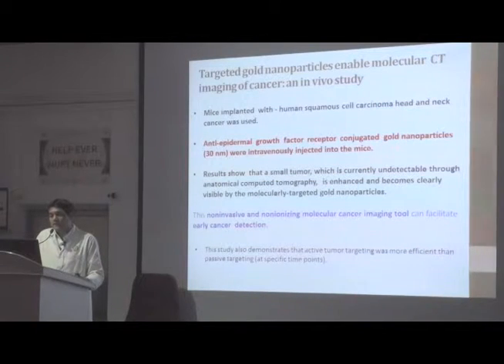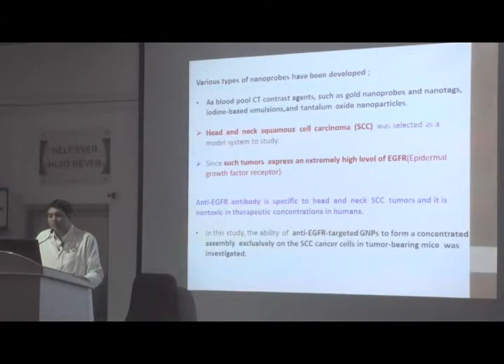Targeted gold nanoparticles. In this study, mice were implanted with squamous cell carcinoma, head and neck cancer. Anti-epidermal growth factor receptor conjugated gold nanoparticles were intravenously injected into the mice, and results showed that the small tumor, which is currently undetectable through anatomical computed tomography, is enhanced and becomes clearly visible by molecular imaging. Molecularly targeted gold nanoparticle is a non-invasive molecular cancer imaging tool and can facilitate early cancer detection. These tumors had extremely high levels of EGFR, which is epidermal growth factor receptor.